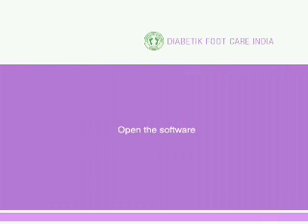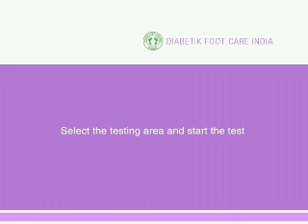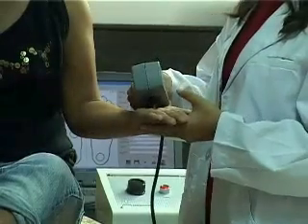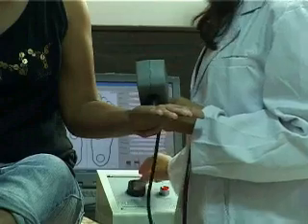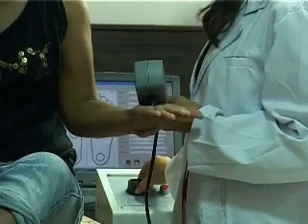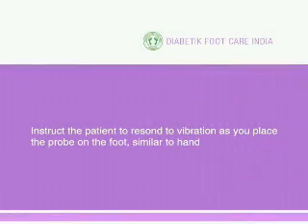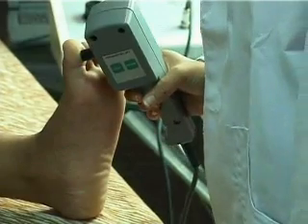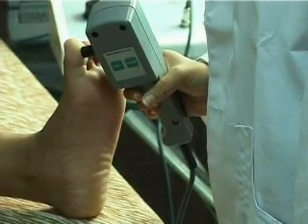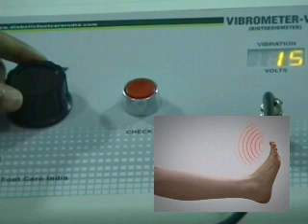Open the software and enter the patient details. Select the testing area and start the test. Touch the tip of the vibration probe on the patient's palm to find out if they feel the vibration, then increase the vibration strength. Instruct the patient to respond to vibration as you place the probe on the foot, similar to the hand. Place the tip of the probe gently at the great toe and increase the voltage slowly.